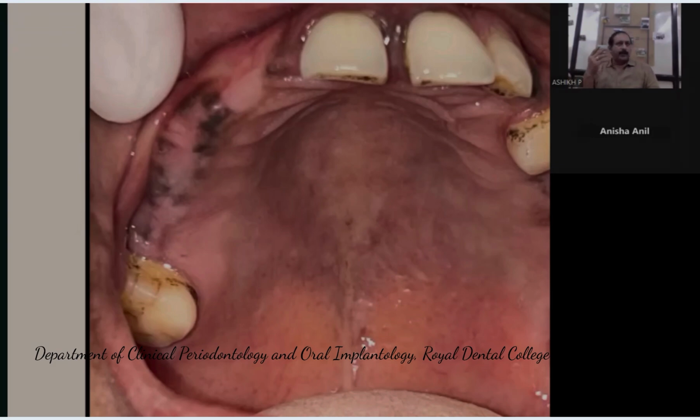So if you are going to place an implant with its outer diameter 2 millimeters away, sparing the bone immediate to the socket area, your lance drill should be how many millimeters away from the present tooth?